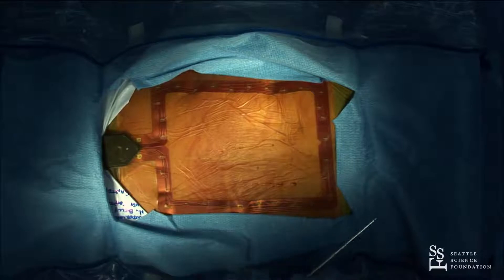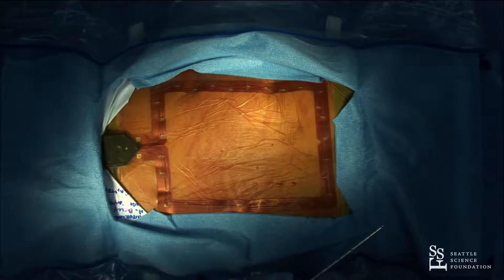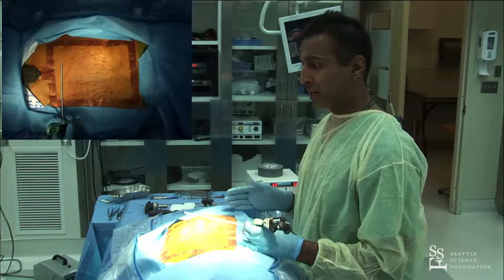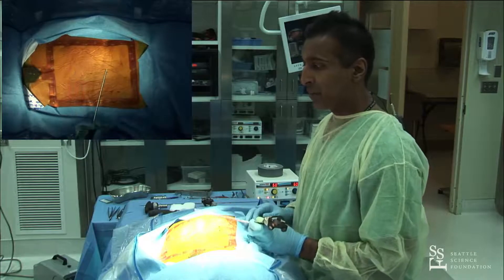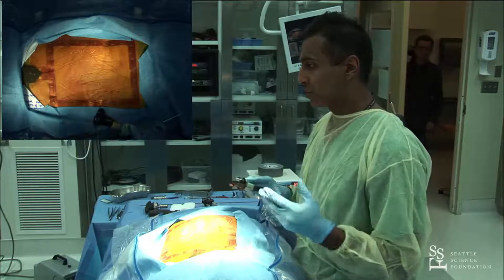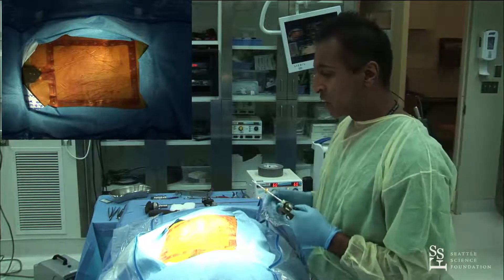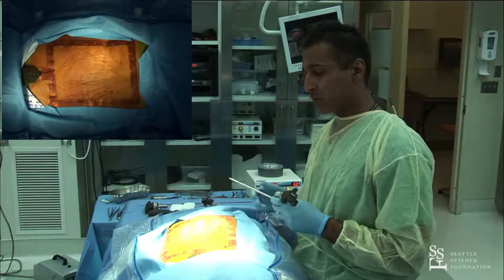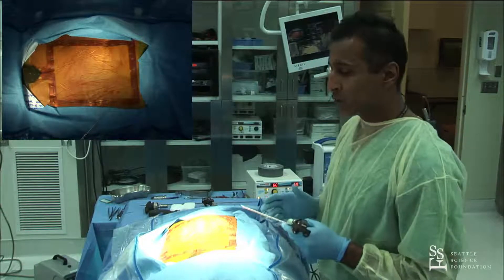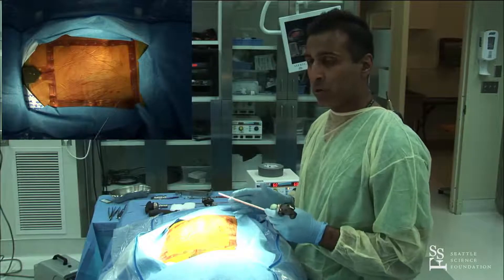You don't necessarily need to work within the confines of that rectangular mask space. As for how many levels — it really depends on the size of the vertebral bodies. It's pretty predictable to do L3 to S1. The mask is approved for the lumbar spine, and I can generally do L3 to S1 within it.